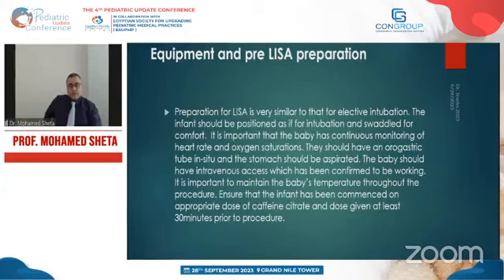The baby should have intravenous access. Of course, all the babies will have a cannula, UVC, or central lines at this time, and confirm it is working in case you need to give medication or sedation. Usually, we give sedation by sucrose only, sucrose drops by the nurse. It is important to maintain the baby's temperature. Of course, we will open the incubator during this maneuver, so it's important to keep the baby's temperature throughout the procedure. The more experienced the personnel, the faster they will do it, which is much better for the baby to keep the body temperature.